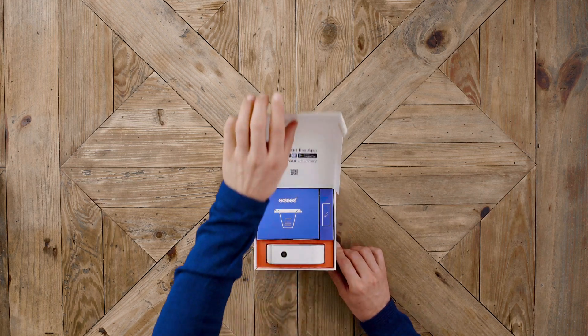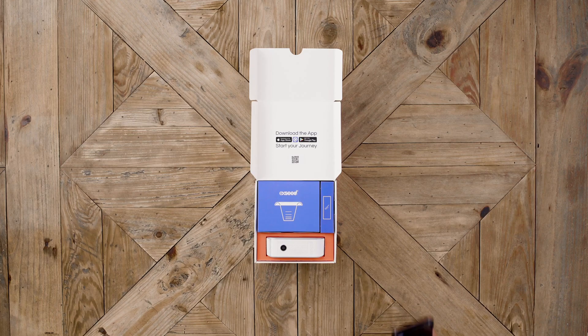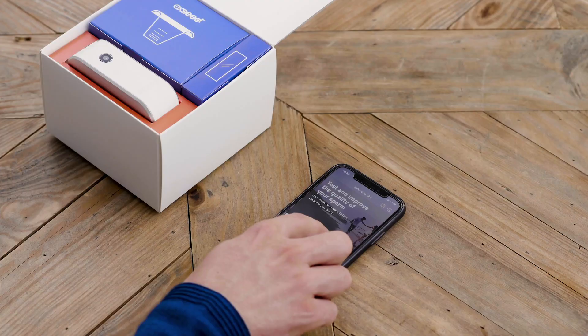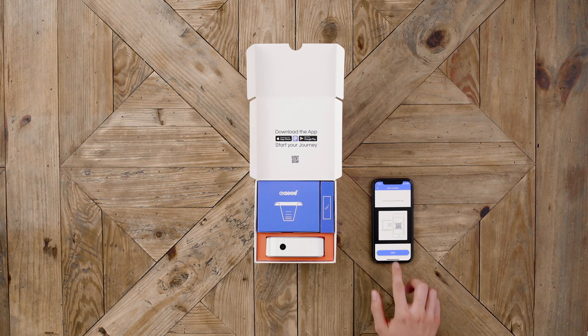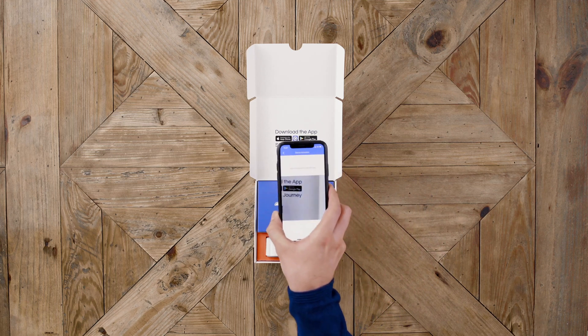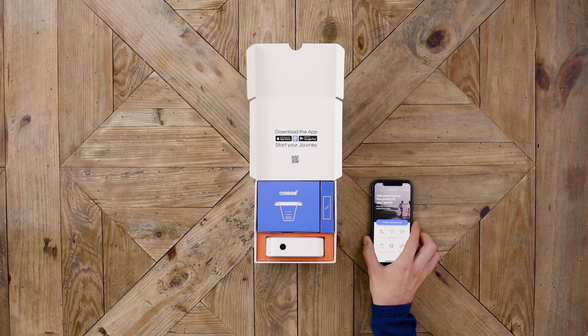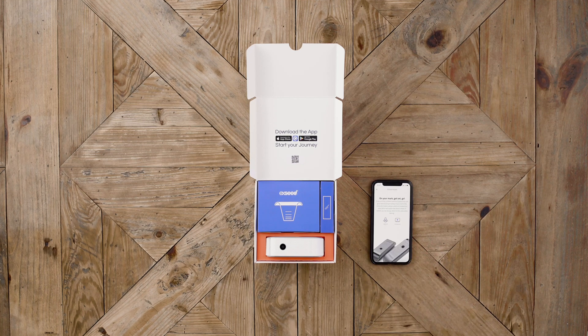Open the exceed box and locate the QR code. Open the app and press the blue button — I'm ready, let's take the test. Scan the QR code to get started. We recommend you watch the introduction video before testing.